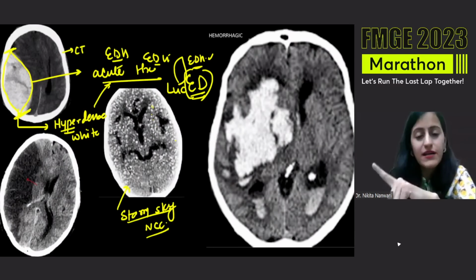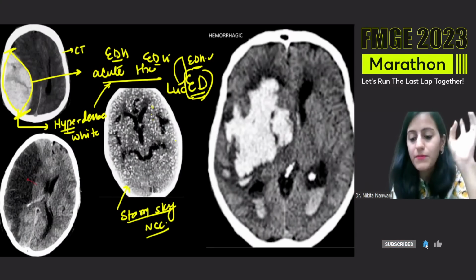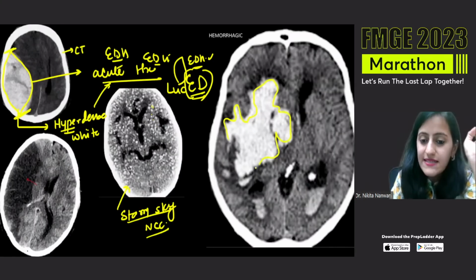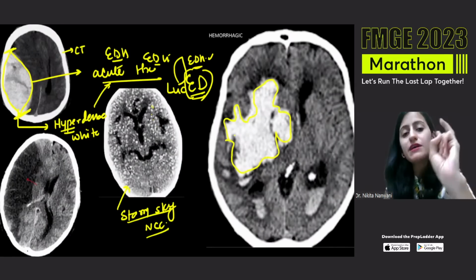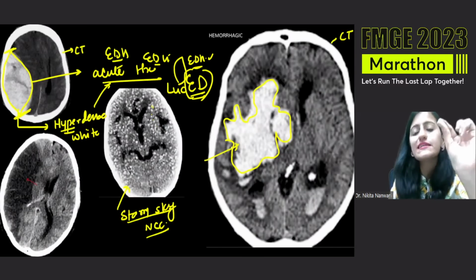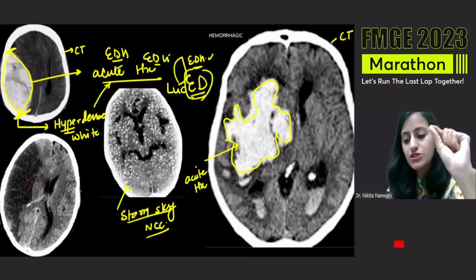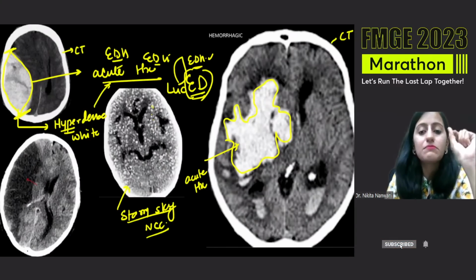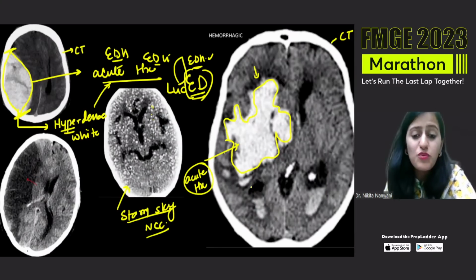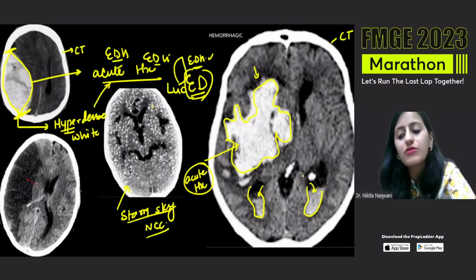Starry sky appearance, Burkitt's lymphoma. Starry sky appearance in the kidney on immunofluorescence is PSGN. Remember all the starry sky. This one here again, tell me what is this? Is this infarct? Is it acute hemorrhage? Is it chronic hemorrhage? This one again is a CT. White on CT is either calcification or acute hemorrhage. So this is acute hemorrhage, which is intraparenchymal, within the parenchyma. So this is acute intraparenchymal hemorrhage, which has intraventricular extension also, extending into the ventricles as well.